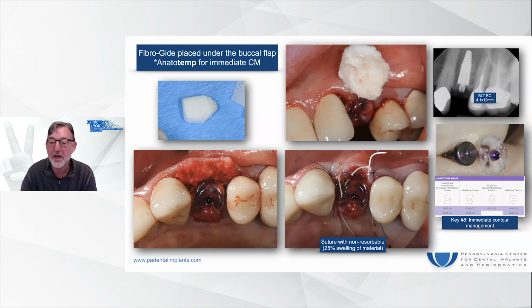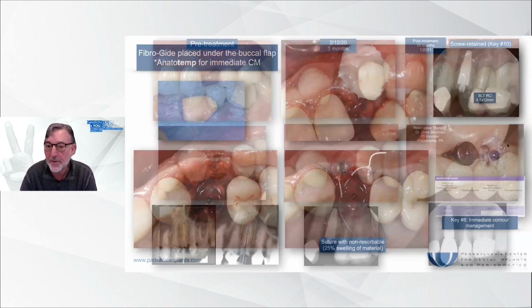Again, discussing with the patient about the swelling. We're in a good prosthetic position, and as Tomas has said, we're at least 2 millimeters subosseous here. If I was to use the Straumann healing abutments, nothing like a customizable abutment, which is anatomically shaped.